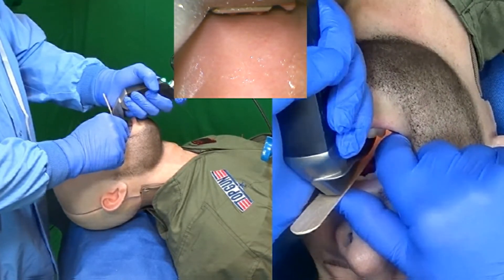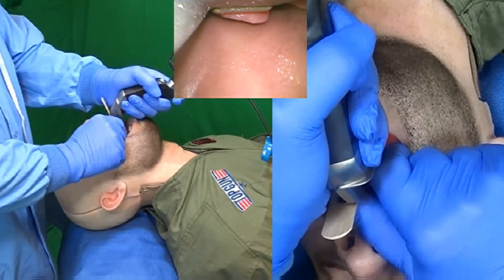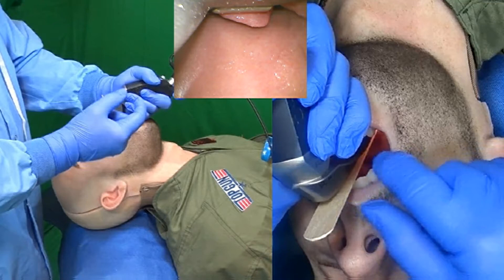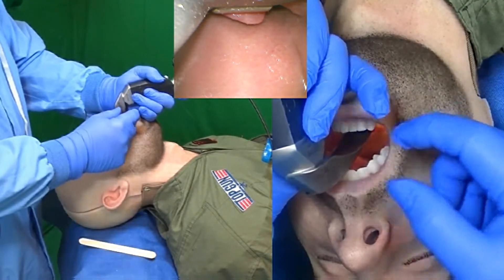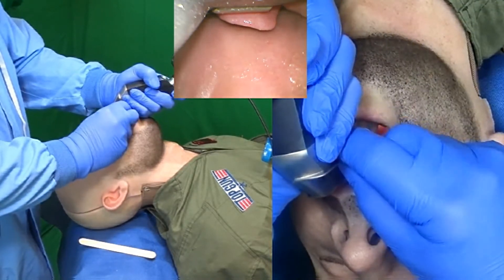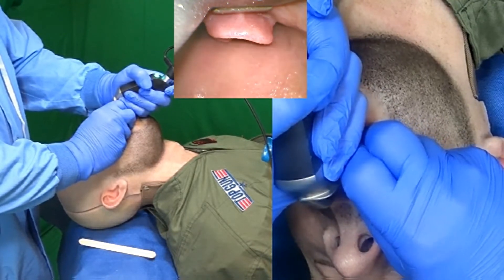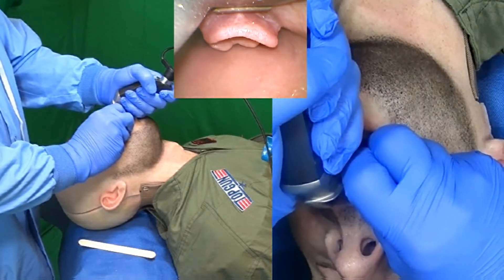I'm going to bring the laryngoscope around the base of the tongue and look at the larynx. I backed it up just a little bit. The next micro skill is something I call the salad pinch. I'm going to pinch the blade with my two fingers and with this right hand perform the micro small maneuver to push the laryngoscope into the vallecula into the proper perfect position.